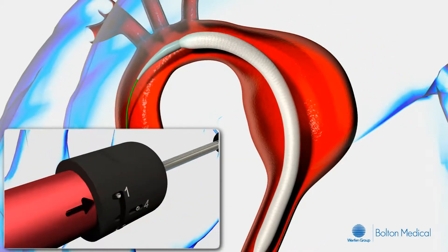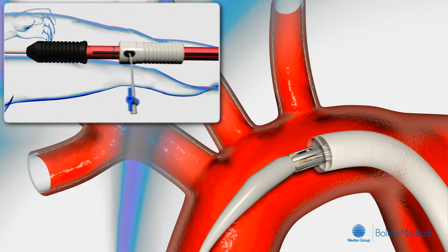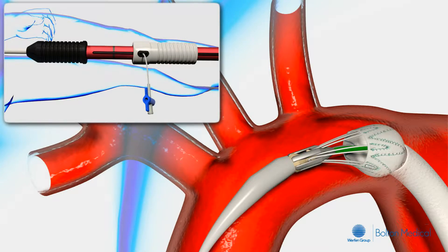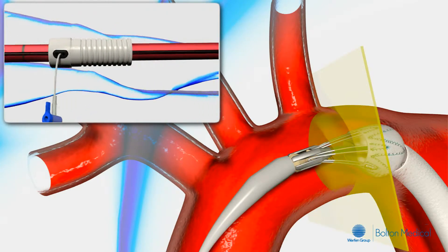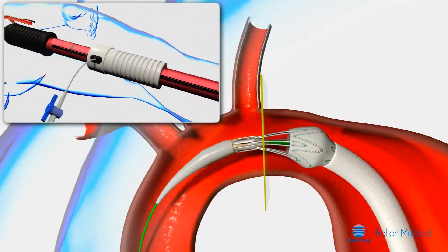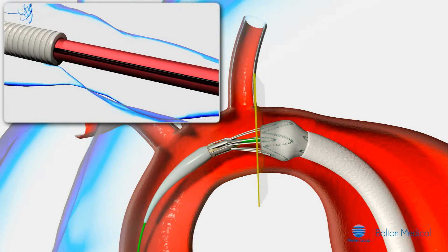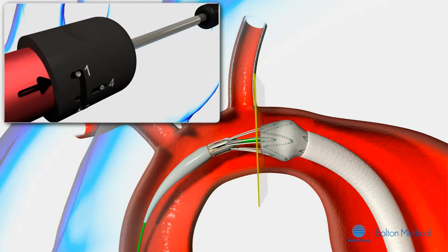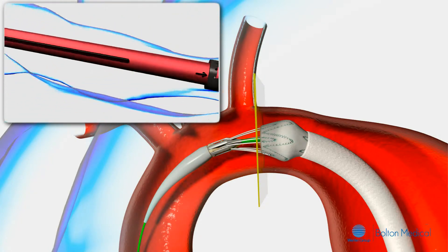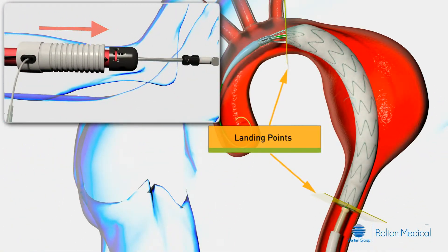Rotate the controller to position 2. Retract the gray deployment grip to uncover the bare and first covered stent. If necessary, make any final longitudinal adjustments by changing the controller back to position 1 and moving the gray deployment grip proximally or distally to adjust the stent graft to the desired location. Change the controller back to position 2 and proceed to retract the gray deployment grip in one continuous motion.